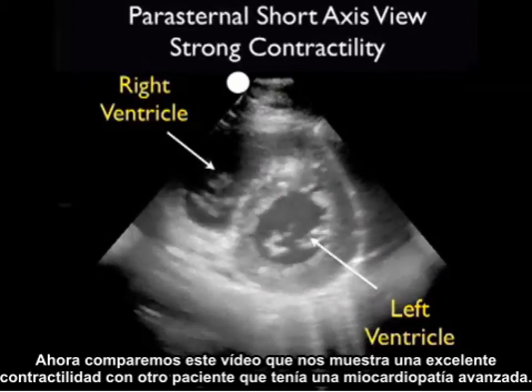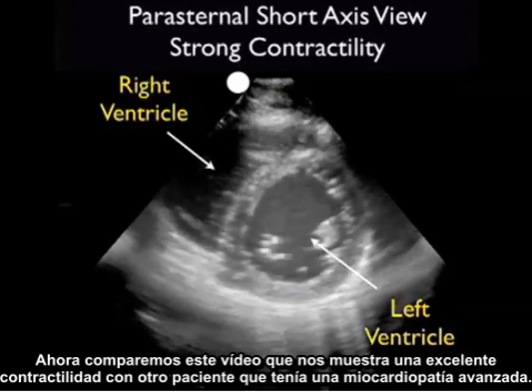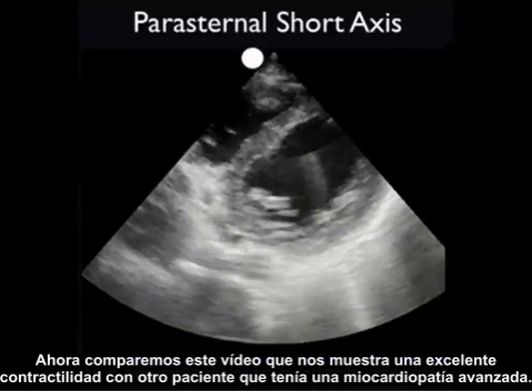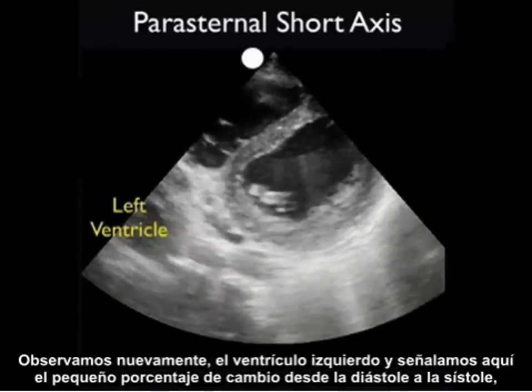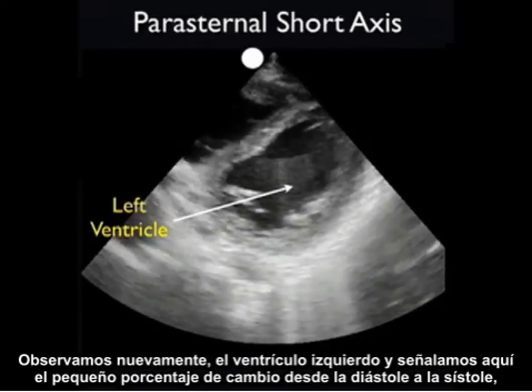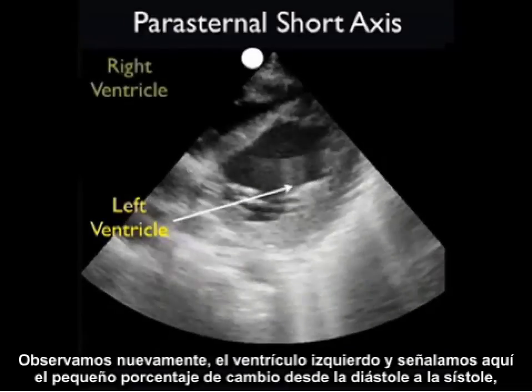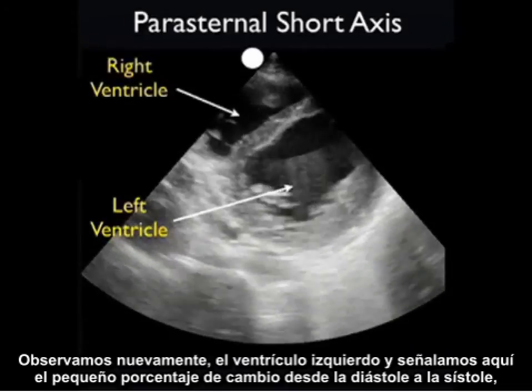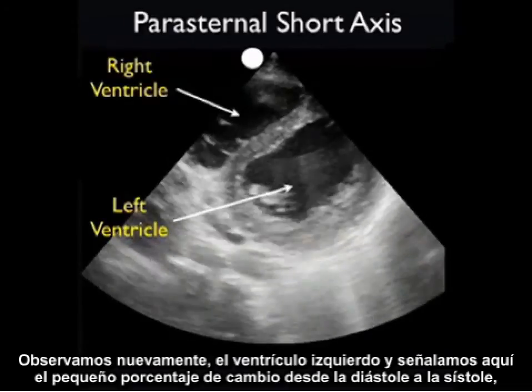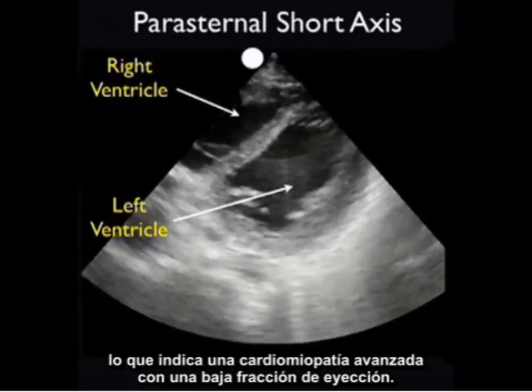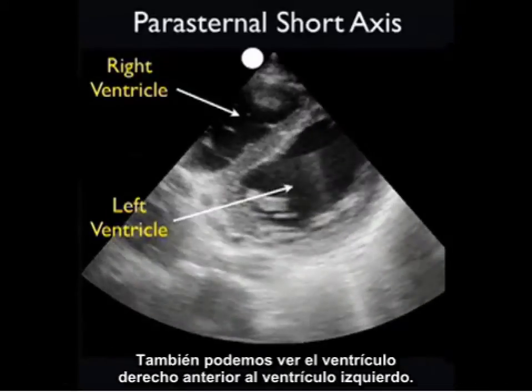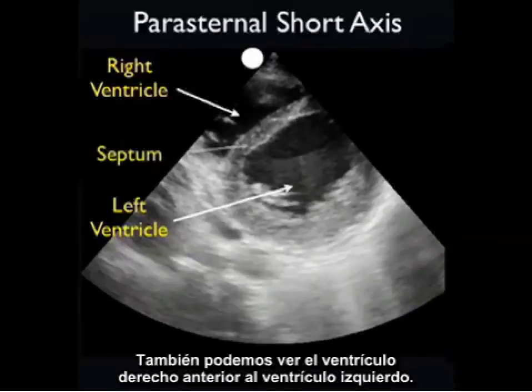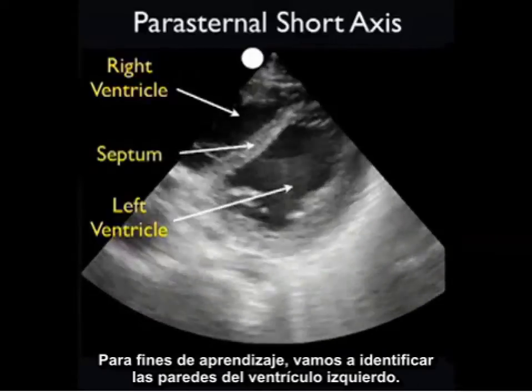Now let's contrast this video clip showing excellent contractility with another patient who had an advanced cardiomyopathy. Note again the left ventricle and note here the poor percentage change from diastole through systole, indicating an advanced cardiomyopathy with low ejection fraction. We can also see the right ventricle anterior to the left ventricle.